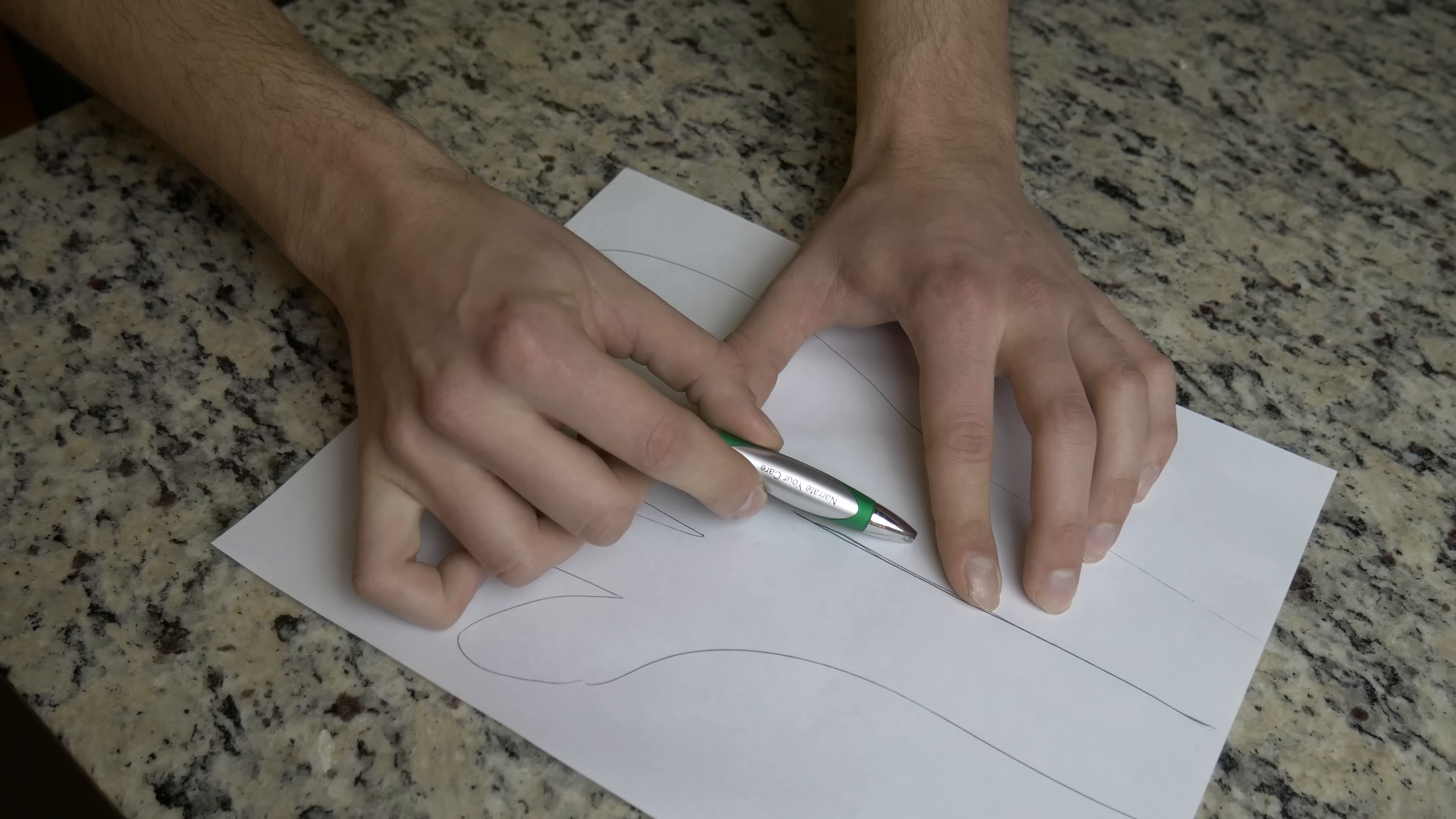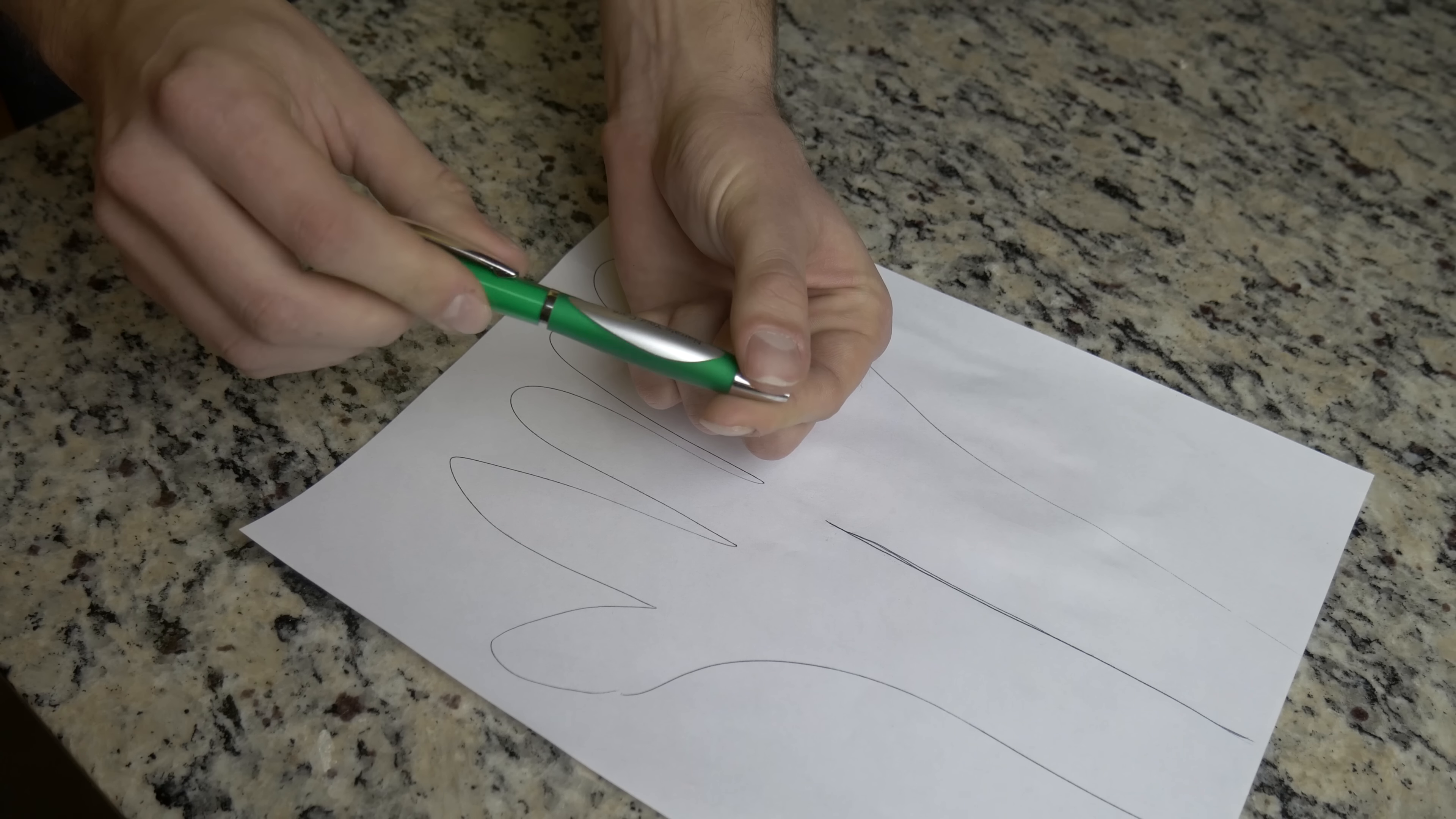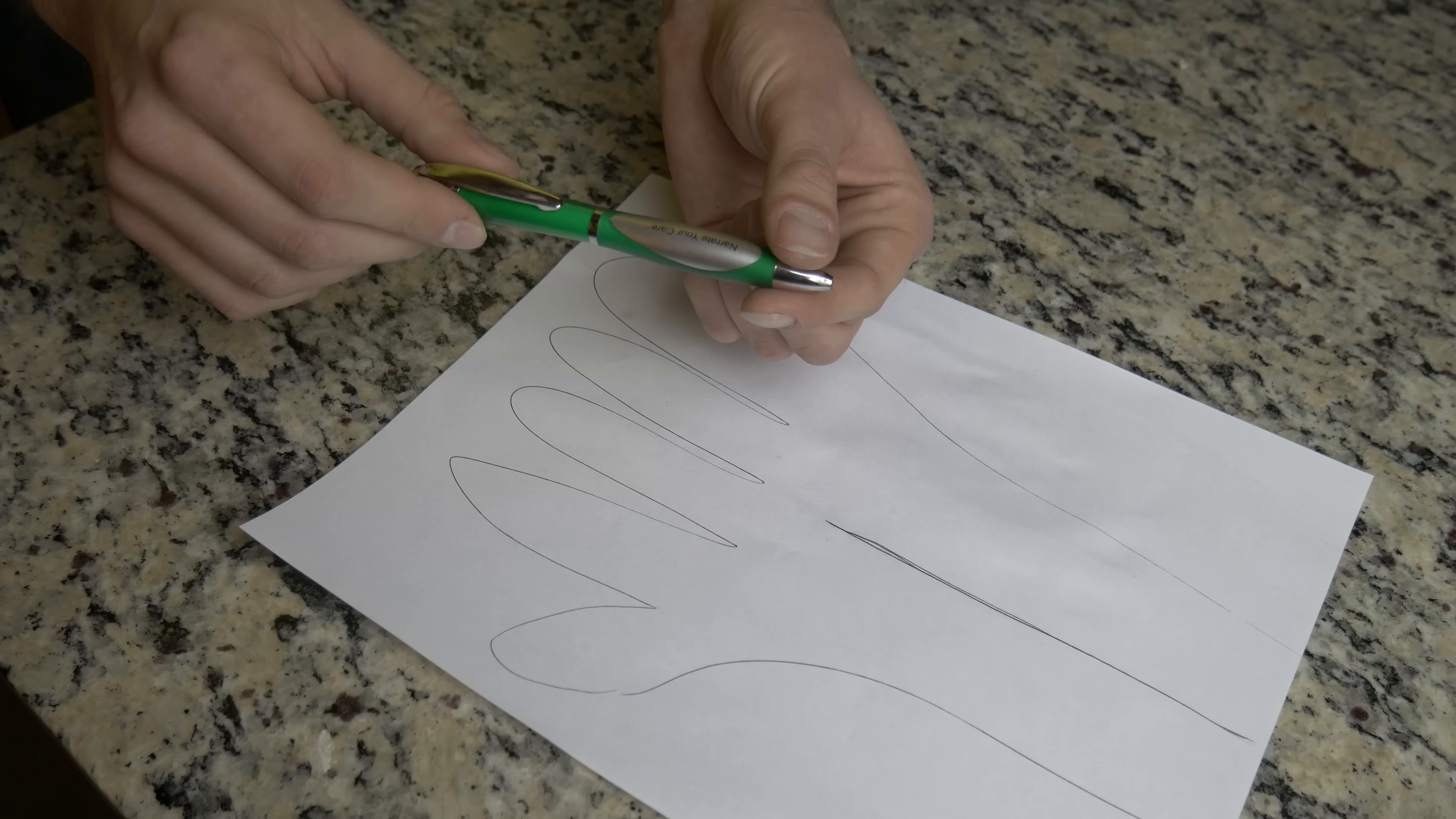And just rotate it like that, kind of spin it, twirl it, wiggle it through that vein. Because when you think about it, it's a lot easier to control movement like this. This is hard because you have a lot of friction and you can't control it so well. When you wiggle it, you have a lot more control over the speed. Also when you wiggle it, it seems to just go through like the twists and turns of a vein and get through any kind of obstacle that you might have.